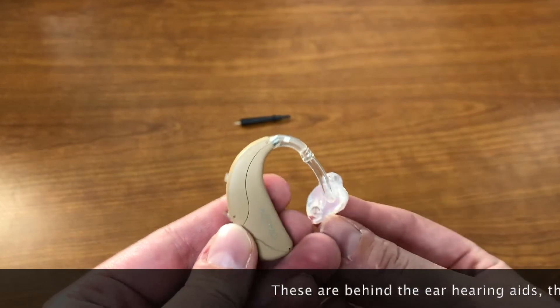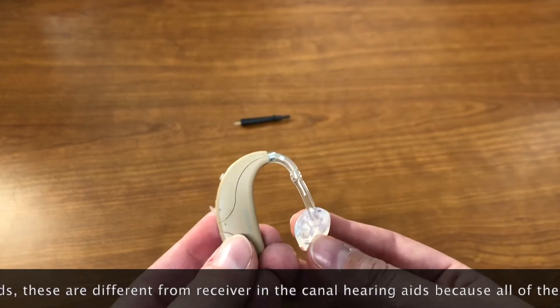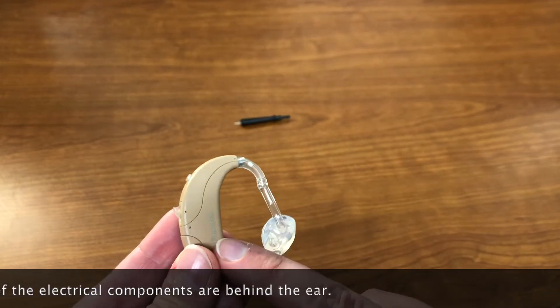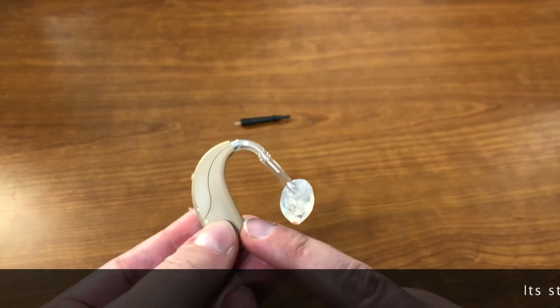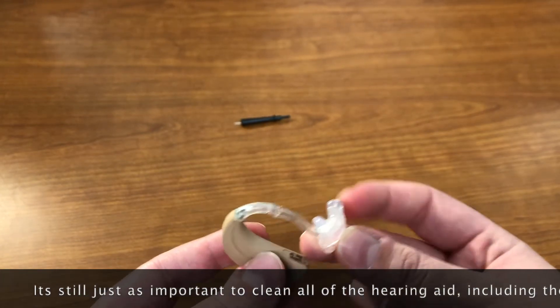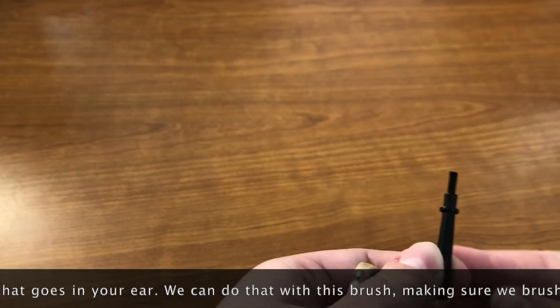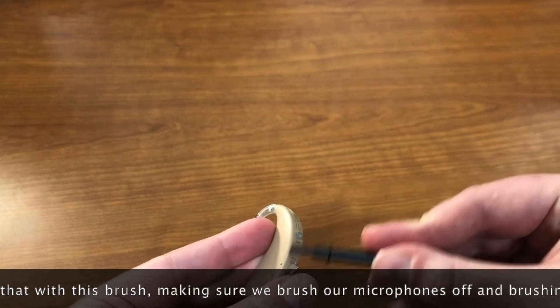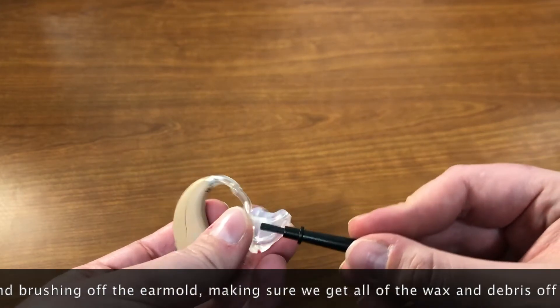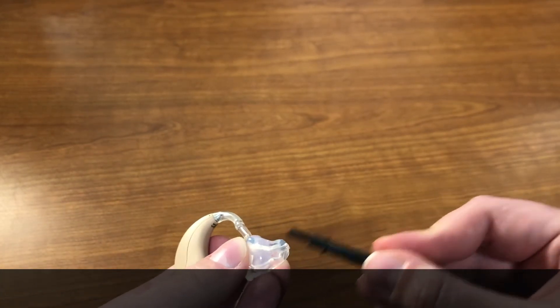These are behind the ear hearing aids. These are different from receiver in the canal hearing aids because all of the electrical components are behind the ear. It's still just as important to clean all of the hearing aid, including this part that goes in your ear. We can do that with this brush, still brushing off the back to make sure we brush our microphones off, and brushing off the ear mold to make sure we get all of the wax and debris off of it.